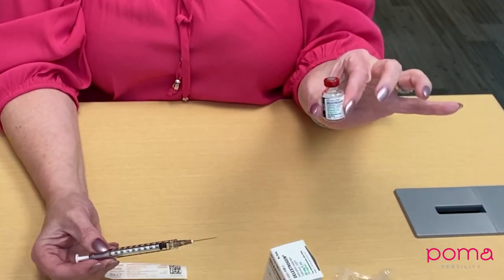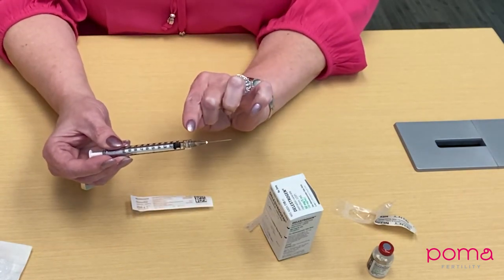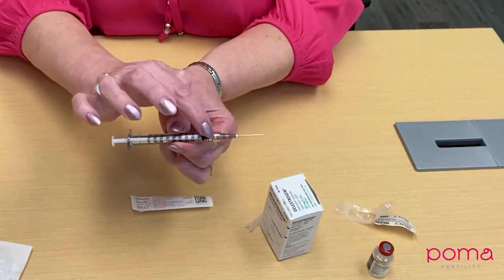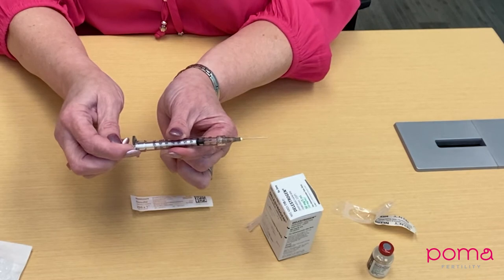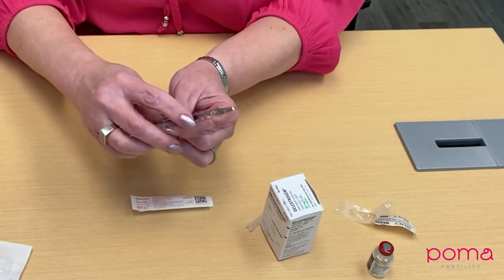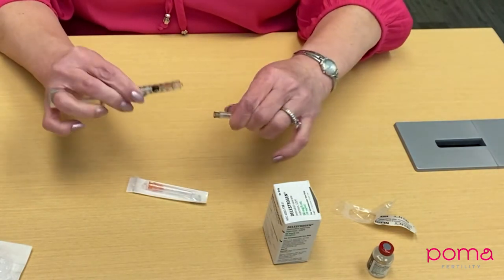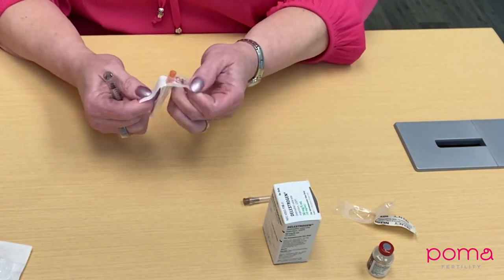Delestrogen never goes in the refrigerator — maintain it at room temperature. This next is a critical step which makes the difference between the success of your treatment or failure. Now that you have the medication drawn to 0.05, pull back all of the medication into your syringe — you will notice it has virtually doubled the amount of liquid. At this point, take off your draw needle and put on your give needle.